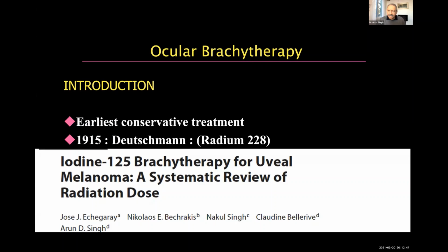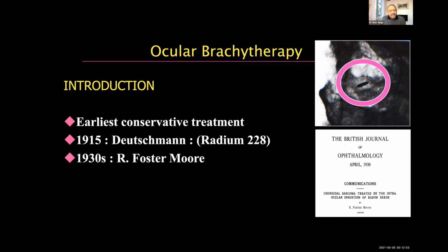So coming back to what we normally understand, the credit goes to Foster Moore from London, England, who came up with the idea of doing radiation therapy for uveal melanoma. And here's an x-ray from his article from many years ago. You can see the radon seed has been inserted through the sclera into the tumor and was left there. This looks almost like what people do for prostate. They put the seeds and the seeds stay for a long time. And this was published in 1930, and this is 2021. So think about that.